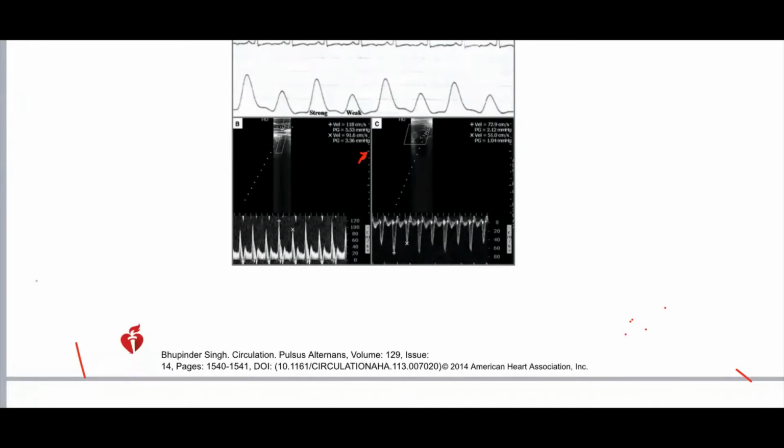No, not at all. That's an electrical activity picked up by the ECG due to pericardial effusion and swinging of the heart closer to and away from the chest. And this is because of severe LV dysfunction. Okay. Now, what is this?